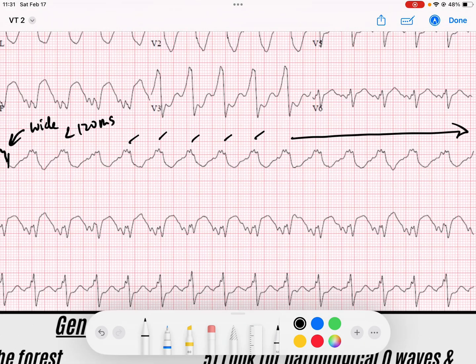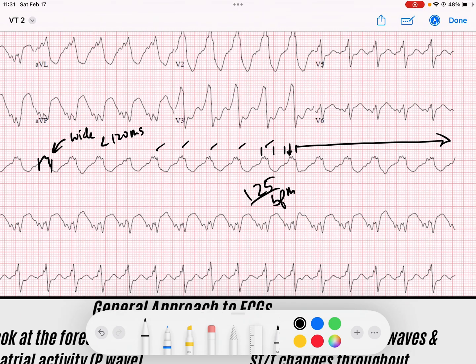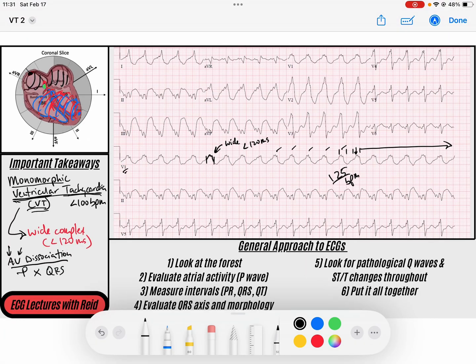It's going to be fast. Let's check the rate. If I choose a QRS that lands on a solid line, we've got 300, 150, 100 — somewhere between 100 and 150 to get to this point, so maybe this one is 125 beats per minute. So we've got a rapid, wide complex, monomorphic tachycardia.